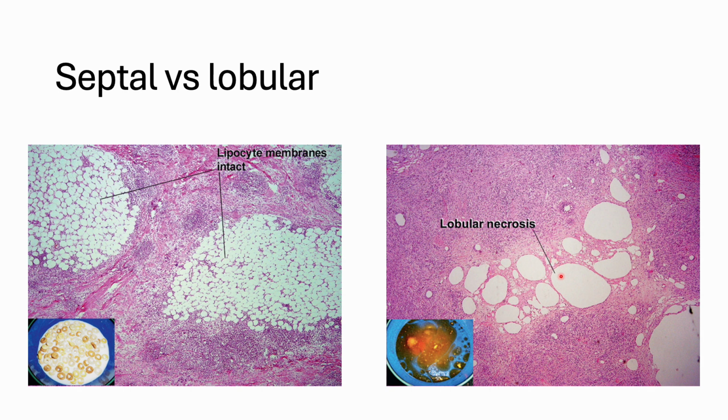On the right, it is the lobular panniculitis. You can see the lobules are necrotic. So those fat lipids just merged together. The lipophages are common, and the necrotic tissue, the lipids, accumulate in pools with varied size and shape. So that's why at low power, they resemble a bowl of chicken soup. So that's why I put those 2 pictures on the first slide of this panniculitis. I hope that makes sense and helps you to remember it.